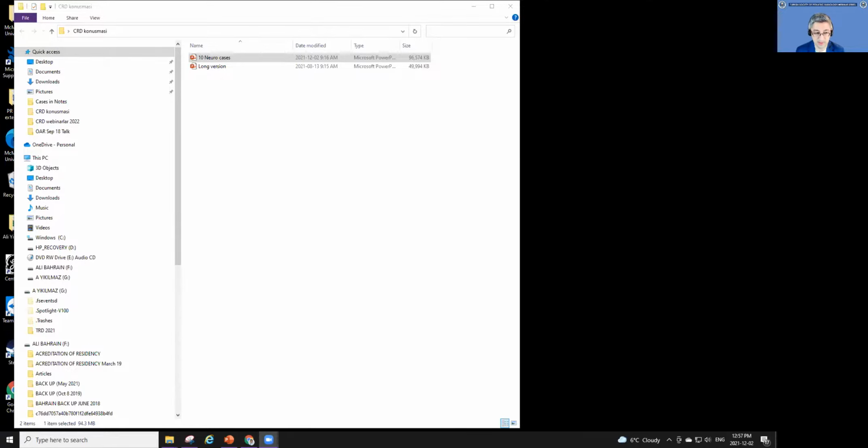So I see this differentiation in the hemorrhage as well. Sometimes they call it germinal matrix hemorrhage, sometimes subependymal hemorrhage. For example, grade 1, the neonatologists usually call it a subependymal hemorrhage. You can also call it germinal matrix grade 1 hemorrhage. And subependymal is, I think, just by location.